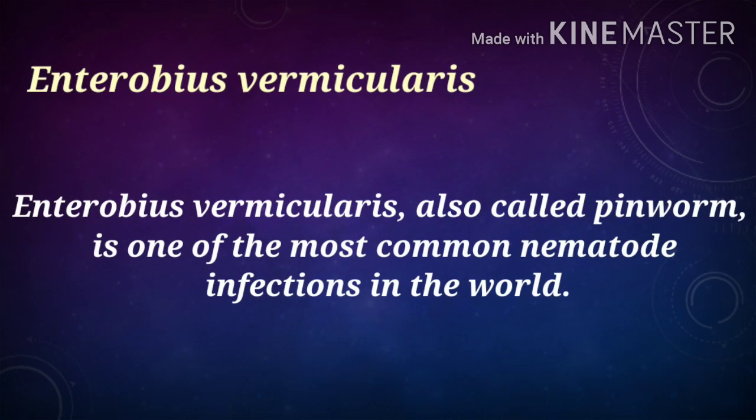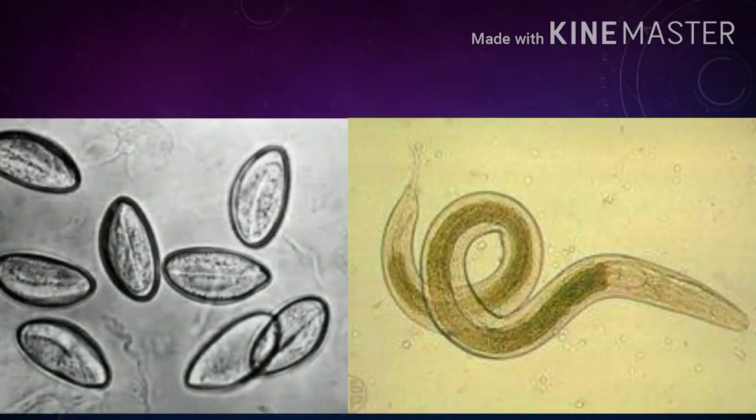Next is Enterobius vermicularis. Enterobius vermicularis is also called the pinworm. It is one of the most common infections in the world. Look at this picture — the first picture shows the Enterobius vermicularis egg, and the second picture shows the Enterobius vermicularis worm.